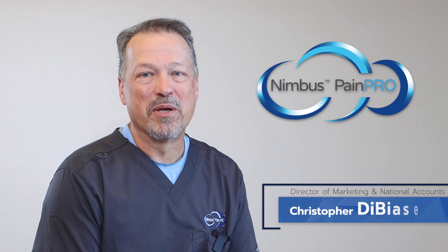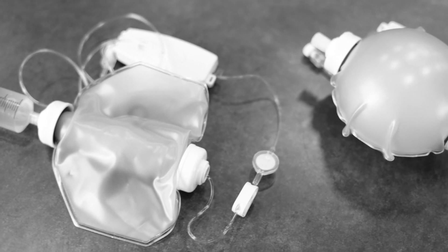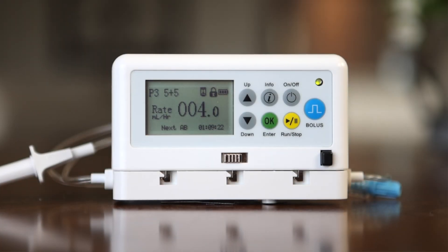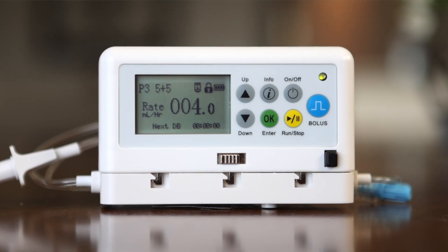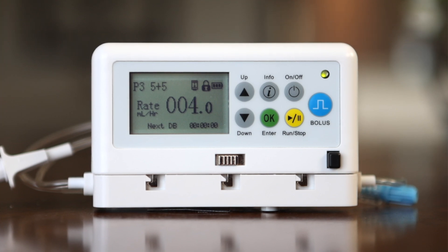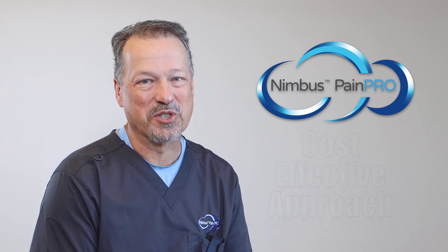I'm excited to talk about the Nimbus PainPro Ambulatory Electronic Post-op Pain Pump. At first glance, when compared to the typical ball-type elastomeric pain pump, you can immediately see the differences. Through the use of advanced technology and a user-friendly form factor, we've enabled the most effective and efficient post-op pain management solution available for patients and clinicians alike. Let me highlight just why the Nimbus PainPro is a better, more advanced, cost-effective approach to post-op pain management.